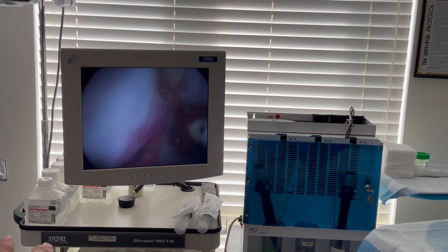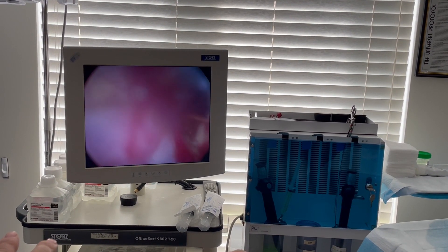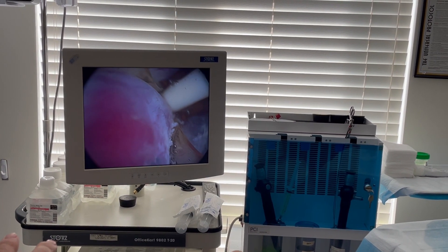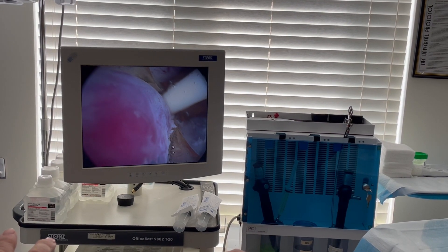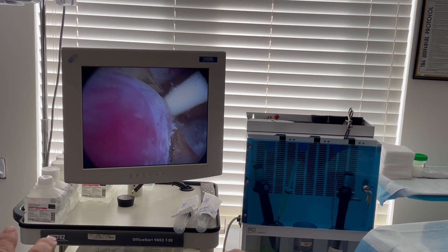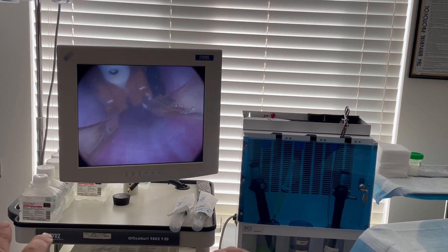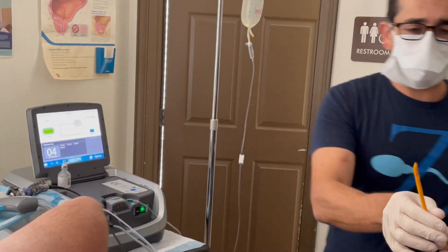He has a short prostate. Ten seconds left, my friend. Very good. We'll put a catheter in now.